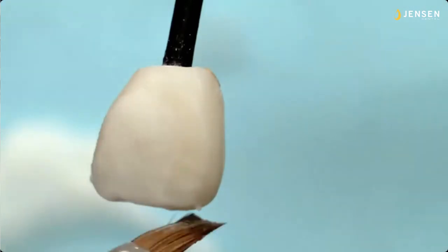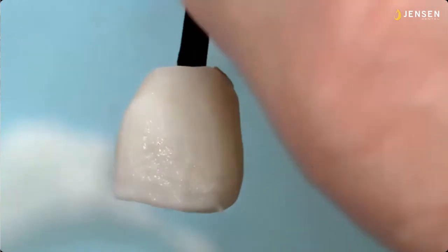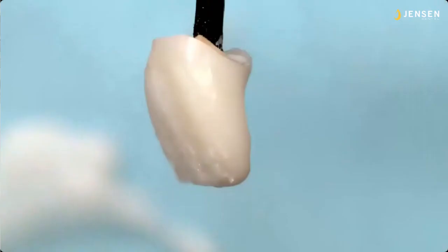And you can use a little bit. What I normally do is get the brush about halfway full of water, and I wipe it on my finger and get a little bit more water out. You don't want more than about 20 or 30% content of water, or it'll really get soupy. So you can see the liquid content in it now. Now it looks like it's real thick, doesn't it?